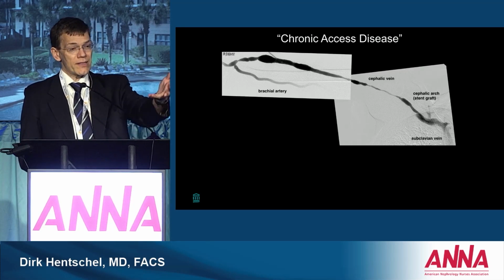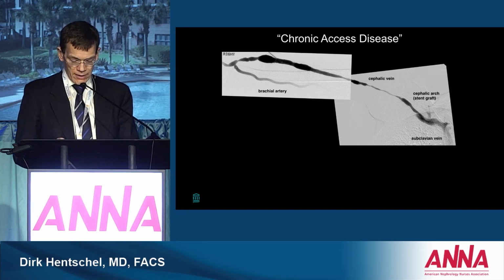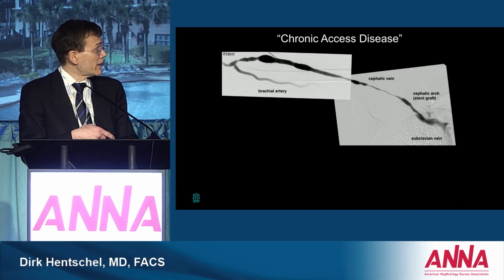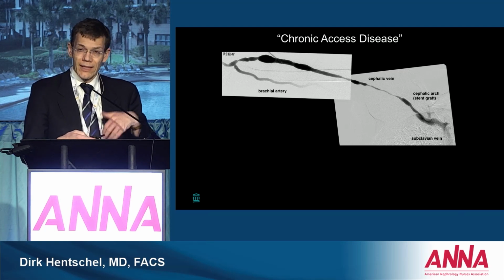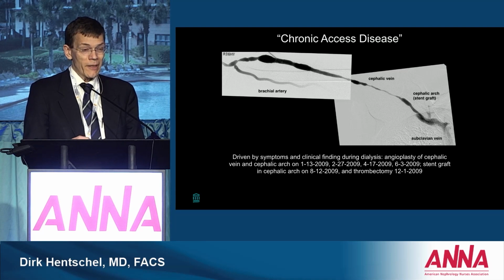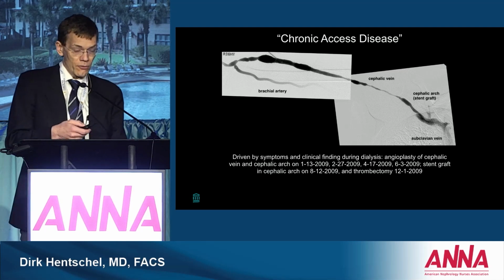And so you can see this access now, several years down the road, has seen some injury where you basically still have kind of the narrowings in the inflow, and we never touched those, but you can see that this patient has acquired a cephalic arch stent graft, and then the vein in between the stent graft and the normal cannulation segment that's appropriately dilated is also narrowed and has these recurrent stenoses, so that this patient really has several procedures each year, maintenance that you're probably familiar with if you follow dialysis patients in the unit.